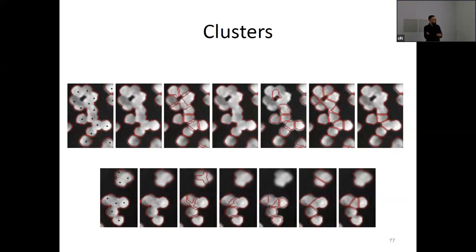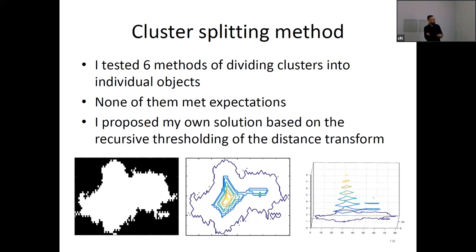This part is quite complex. This is a very difficult example. Very hard to distinguish separate cells here. And this third image is our approach, the one that I used in my PhD that I established.